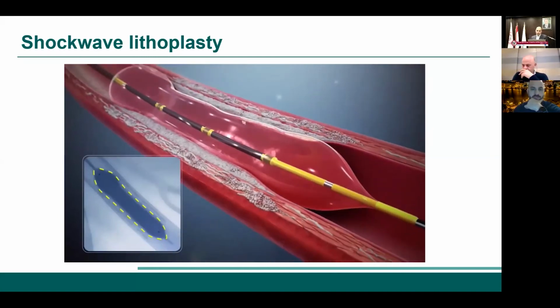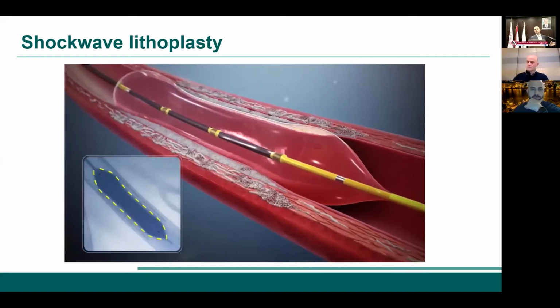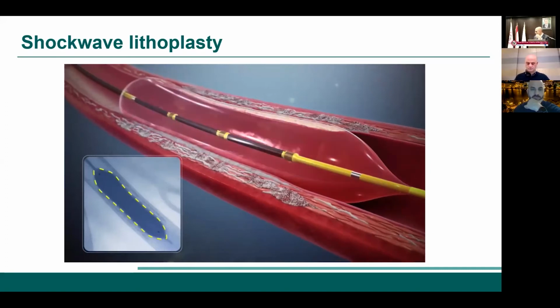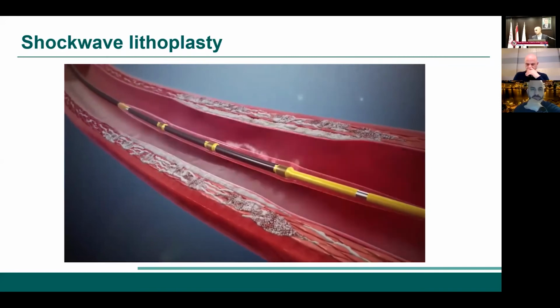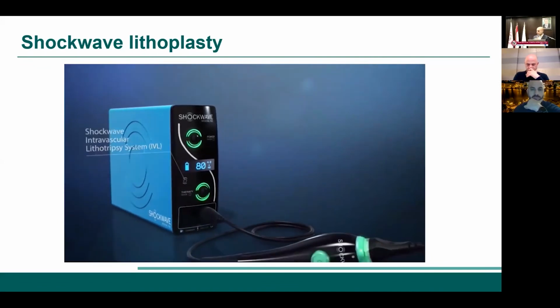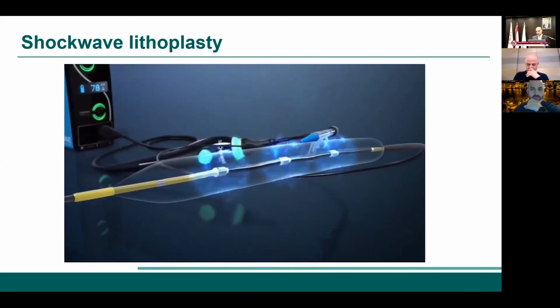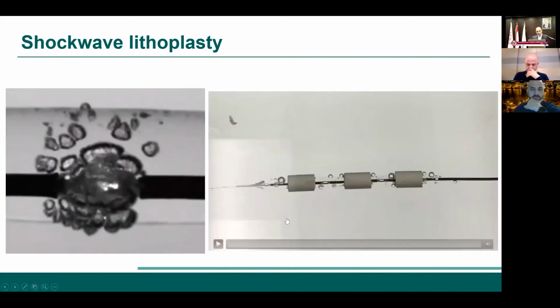And ultimately, you see the lesion yielding. Yet, as was mentioned earlier, even when you use a non-compliant balloon after it, some of us take the shortcut when you see it already yielding. You just think of it as a balloon. Your catheter is done, it's going to be tossed. It's not recommended, but you just inflate it to high pressure. And that's the movie demonstrating, in contrast, how it is.